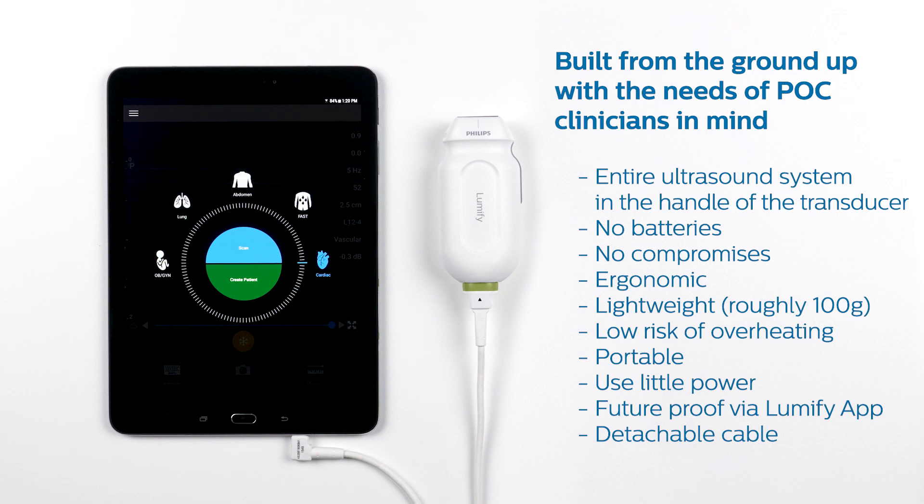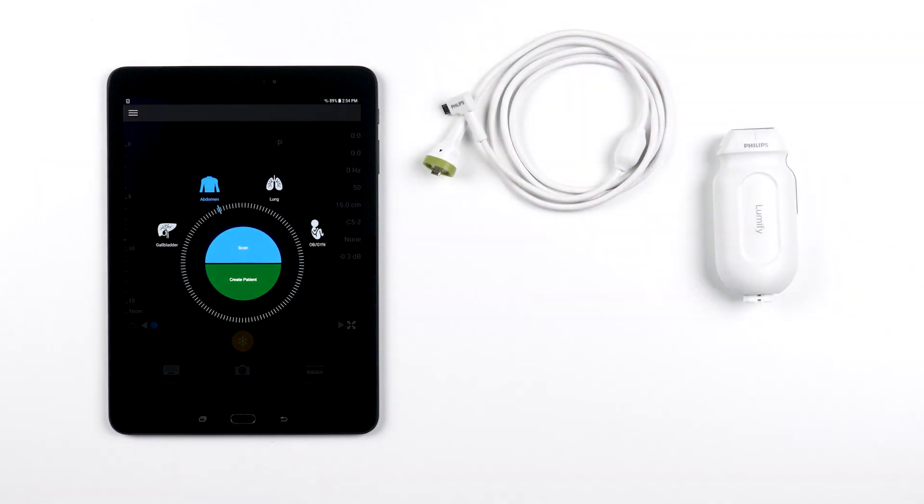We created the cable to be detachable in order to keep up with the latest tablet technology. You can see the transducer is detachable here, and this is helpful for two main reasons. One, point-of-care ultrasound users are in all sorts of different environments, and if this cable ever gets damaged, you don't have to replace the transducer or send it in for repairs. All you have to do to get it back up and running is to simply attach a new cable onto that transducer.